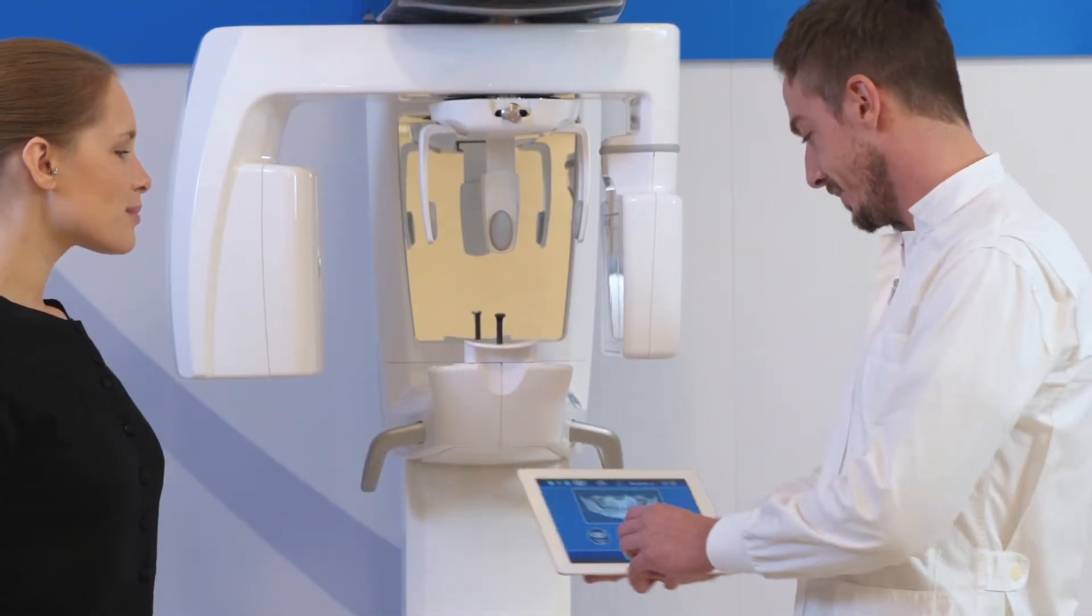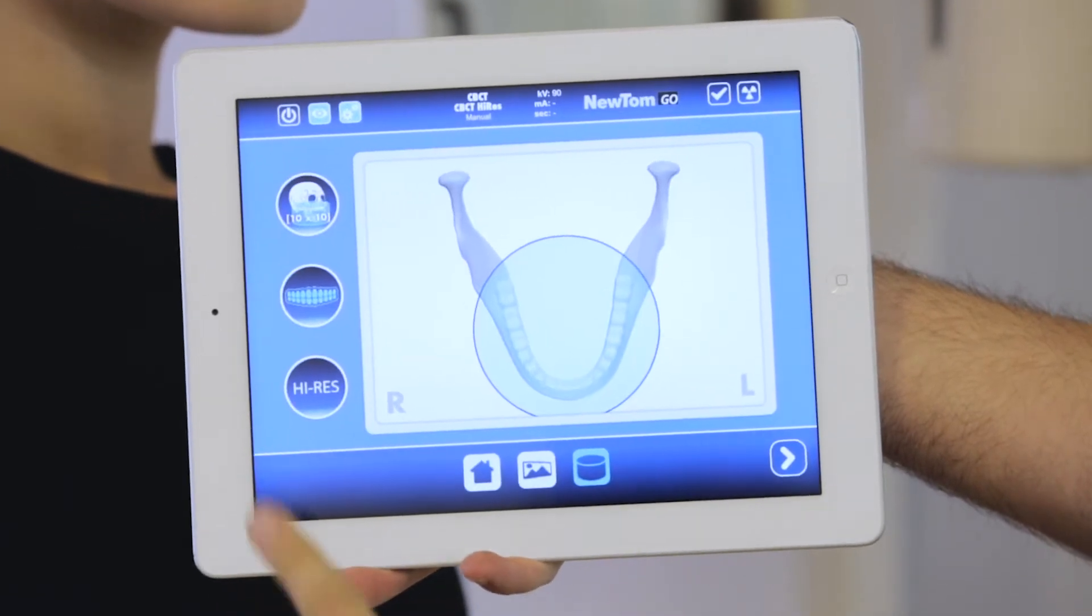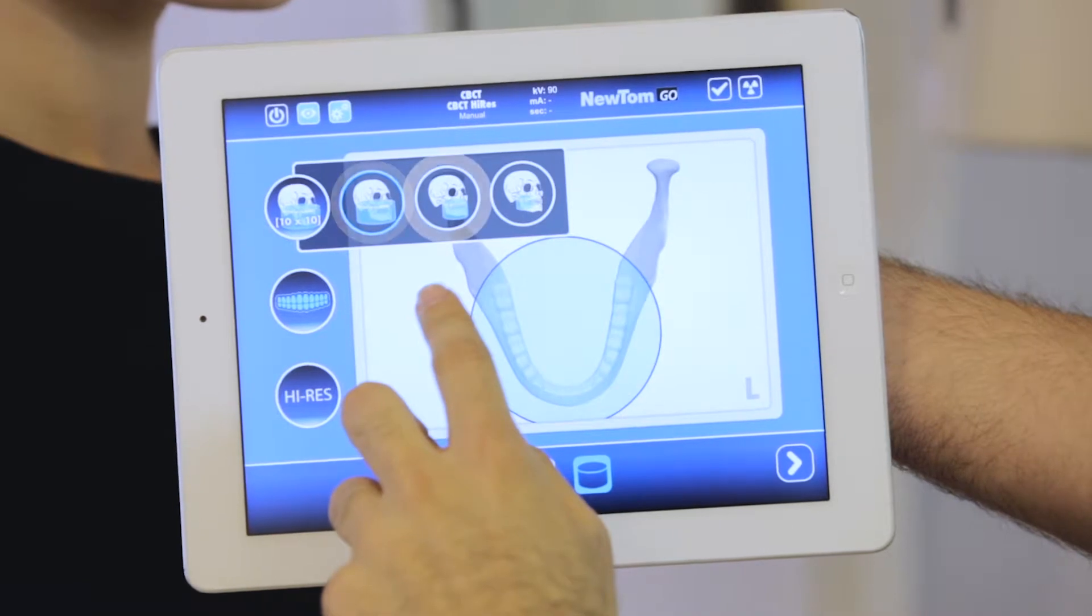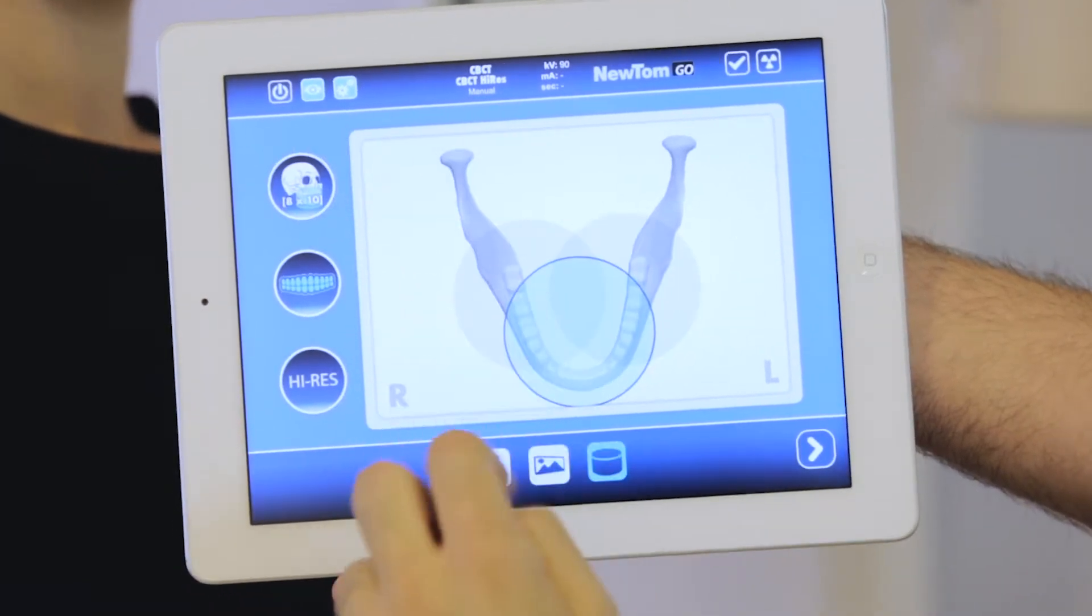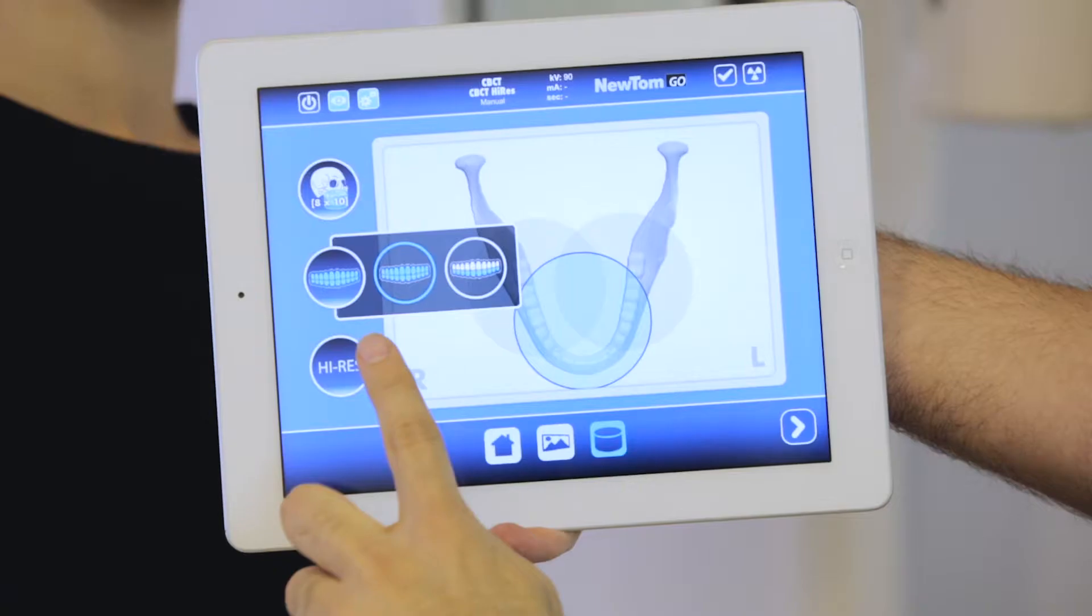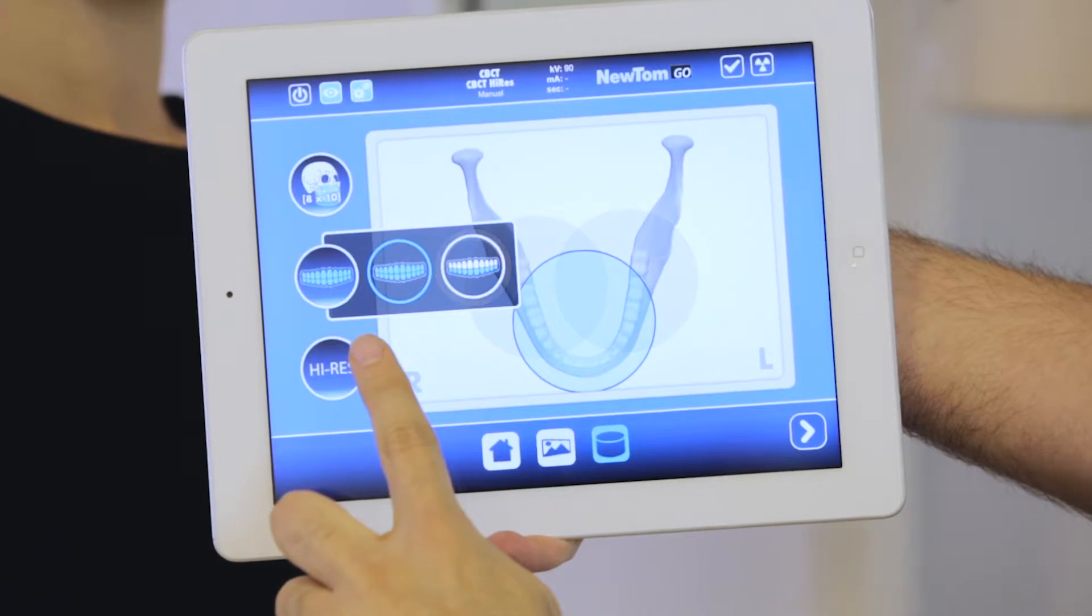Accessing the 3D section, he will find a screen showing the CBCT program. Via the special icon, the dentist selects the size of the field of view from the list. He defines the center of volumetric reconstruction by selecting on the screen the anatomical region of interest.